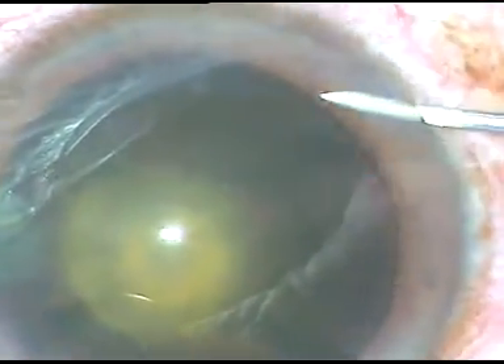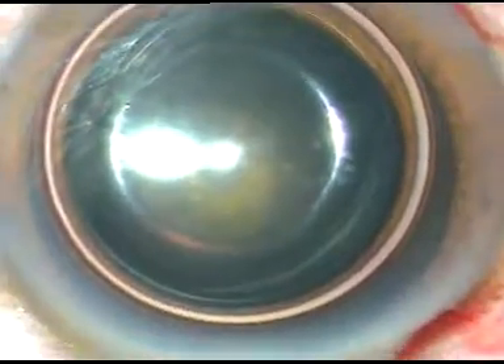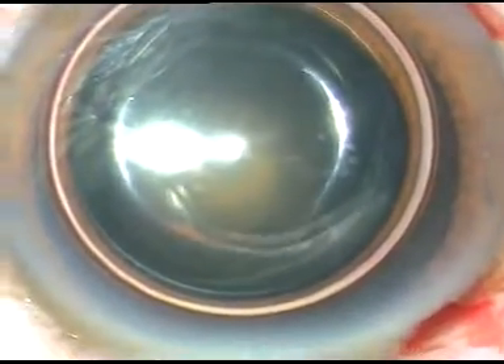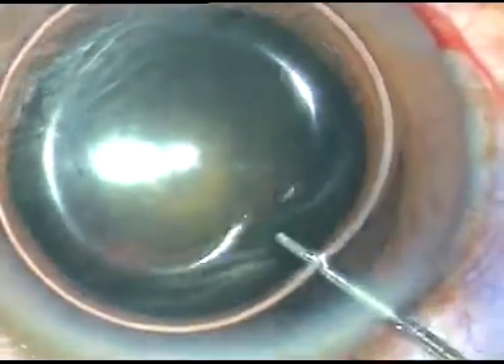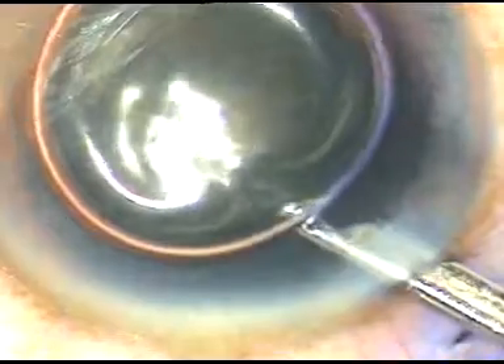By this time, the main incision has been made. One side port has been made on the right side of the main incision. Now, I am going to stain the anterior capsule of this cataractous lens. Trypan blue dye has been used. The dye is being washed out.